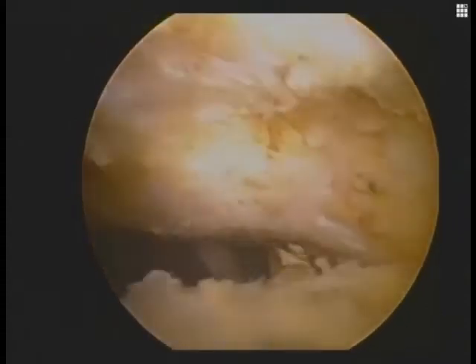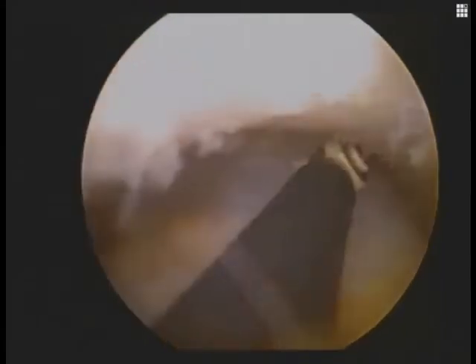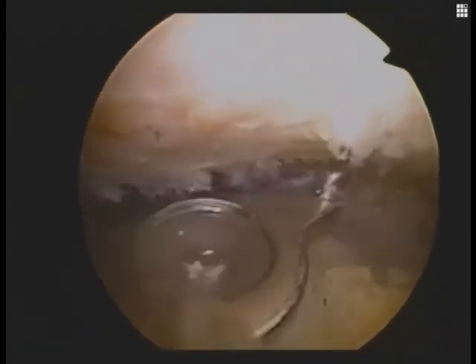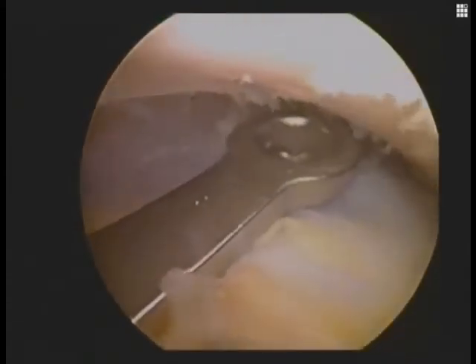We're marking our drill hole here with the cautery at the midpoint of the base of the coracoid. We'll then replace the cautery device with our Arthrex GraftRope guide. The spoon-type guide has a hook on the end to feel the far cortex of the coracoid. We use a fixed-angle guide akin to an ACL guide, which drills down through the coracoid.